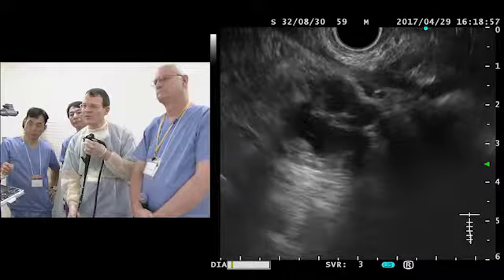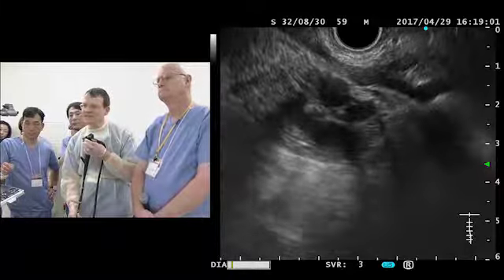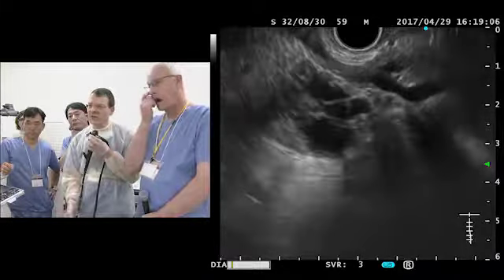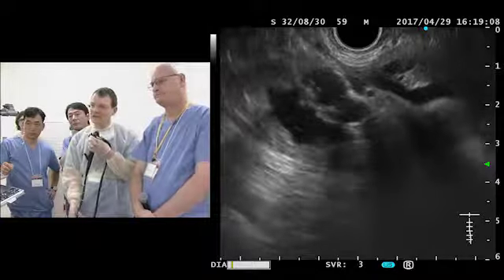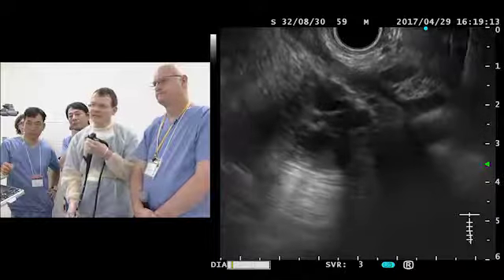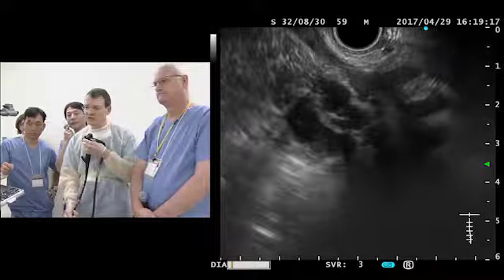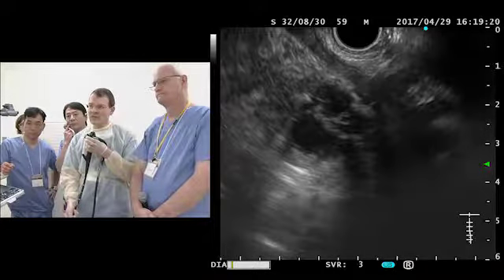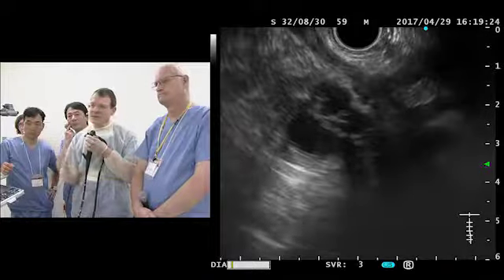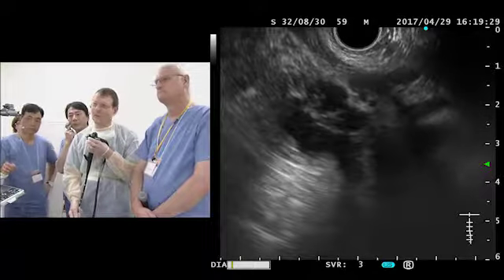And now the next point is, I also look if we can see any calcifications. So far, I don't see calcifications. I would describe that we have maybe echo-rich areas also in the septae, but no real calcifications. But I think this is a cystic lesion suspicious for malignancy because we have many features of malignancy. We have thick septae, we have nodules, and we have a thick wall.